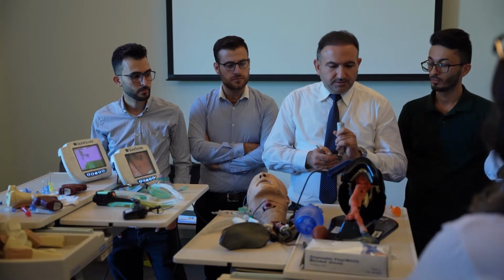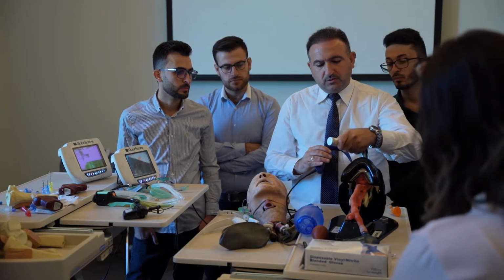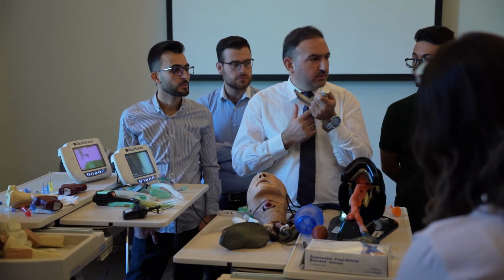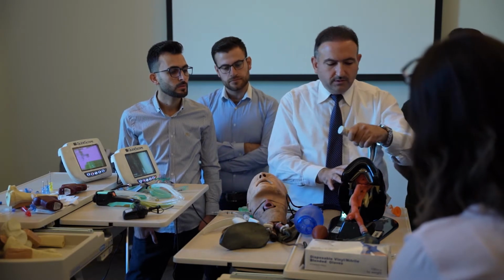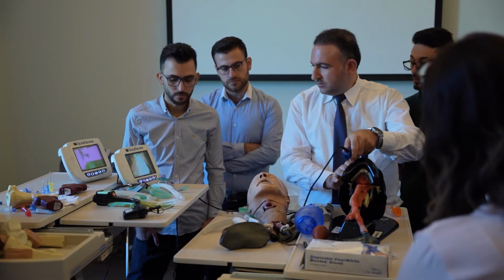Another important point to notice is that you should go from the right to left. Move the tongue to the left and push it away from your vision, to make it easier to put the tube in. So this is the way.